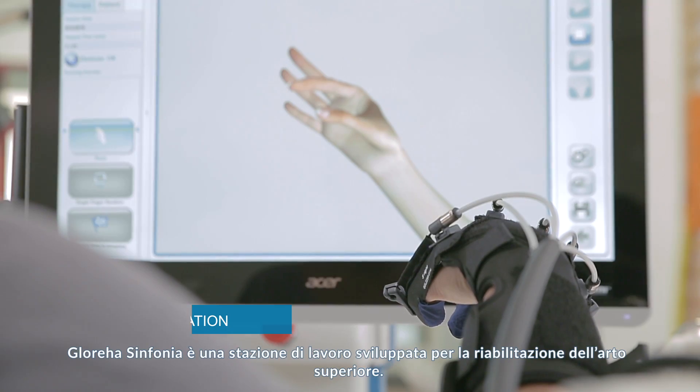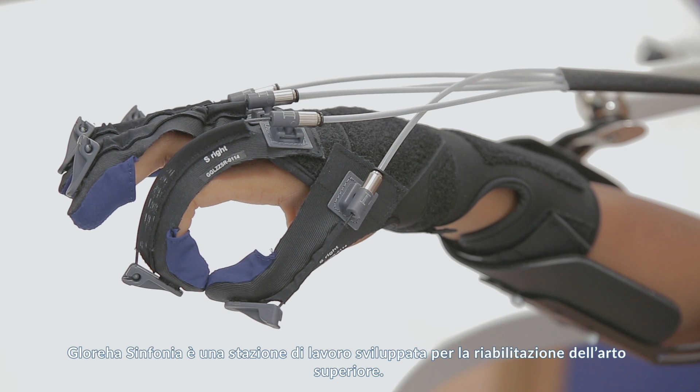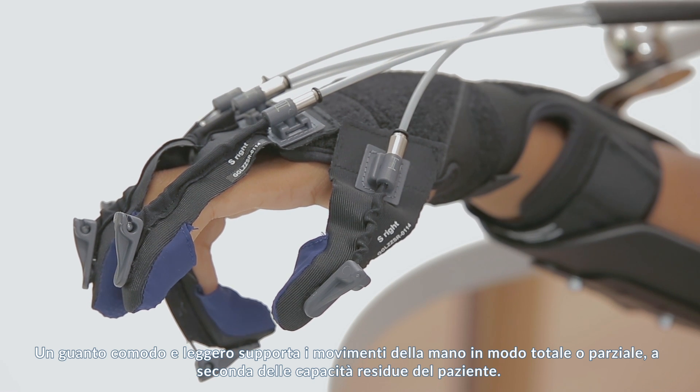Glorea Sinfonia is a complete workstation designed for patients who need upper limb rehabilitation. A comfortable and lightweight glove totally or partially supports hand movements according to residual motor scales.